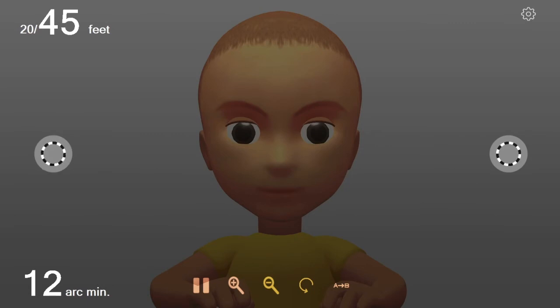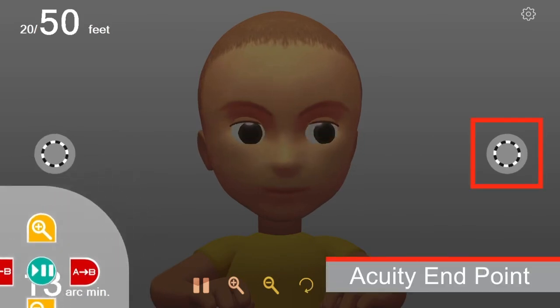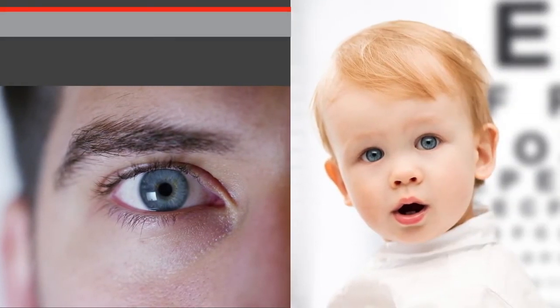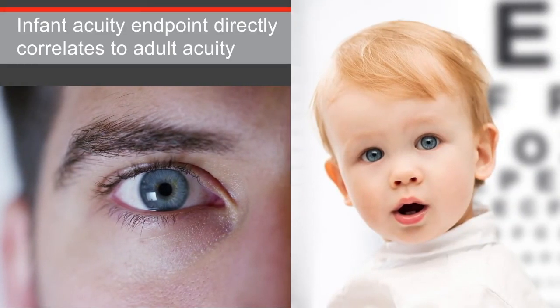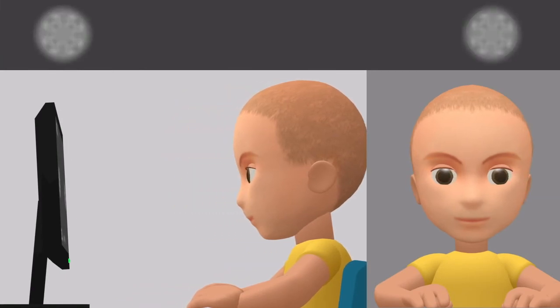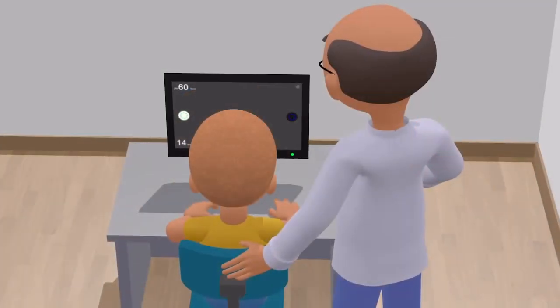make the DIOPs slightly larger until the child is again able to track the location of that rotating DIOP. That smallest DIOP where motion tracking is detected is the acuity endpoint. The infant acuity endpoint directly correlates to adult acuity. You can validate that acuity endpoint by moving the child away from the monitor to see if they lose the ability to track that rotation, or by moving the child closer to the monitor to see if the child can again detect rotation of that smaller DIOP.